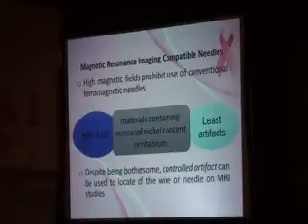Another thing to put at the back of our minds is that even though artifacts can be bothersome, a controlled artifact can help us actually locate the wire or needle. This picture shows an enhancing lesion and the needle beside it.